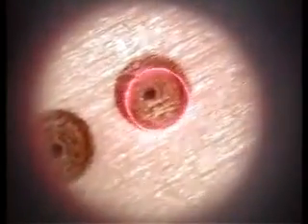A test shooting is carried out on a wooden tongue depressor in order to ensure that the system is working properly. Everyone present should wear protective goggles.